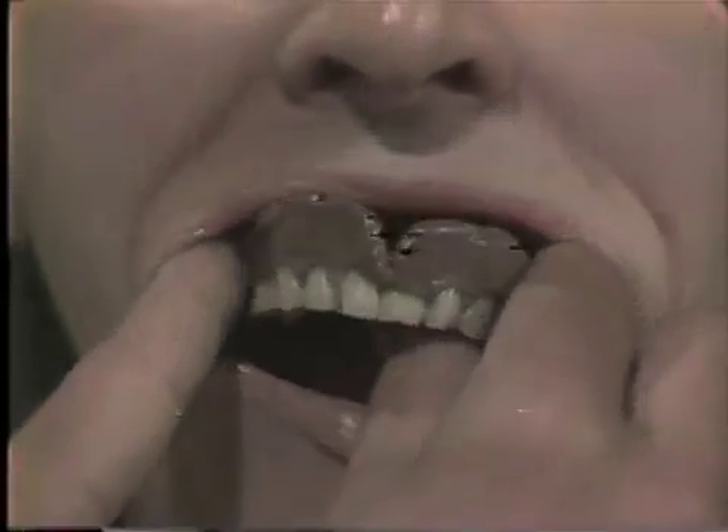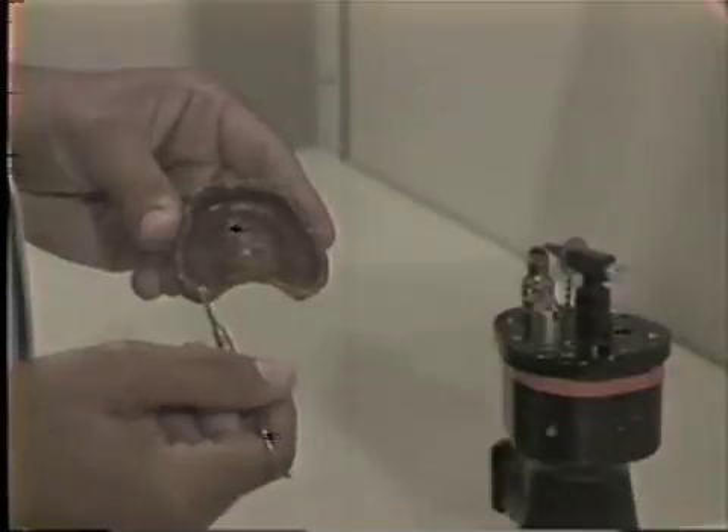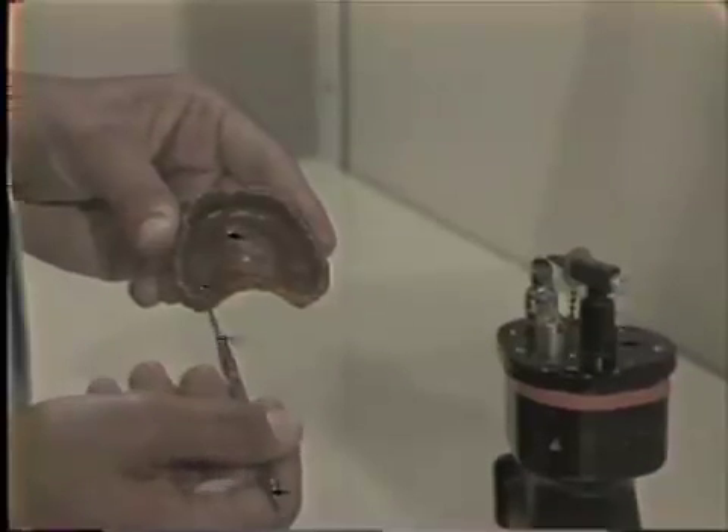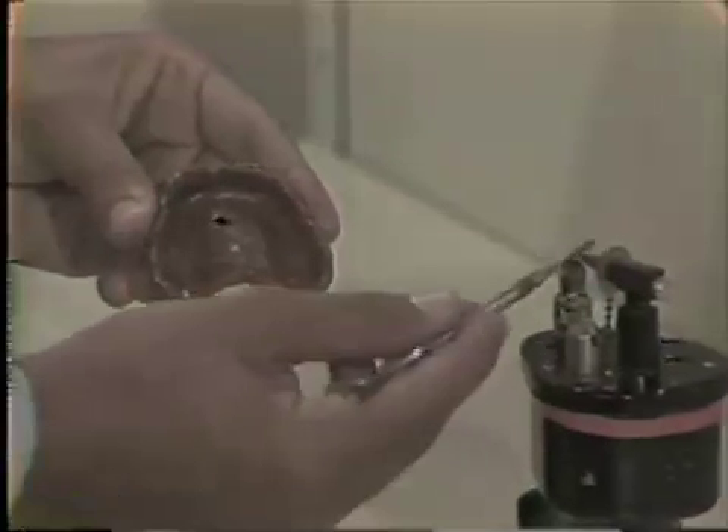Remove the impression from the patient's mouth. If the correcto wax has flowed and adequate retention has been demonstrated, the impression is completed. If retention cannot be demonstrated, more correcto wax should be flowed on the posterior palatal seal until retention is demonstrated.